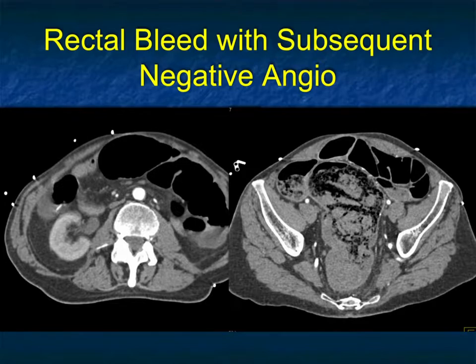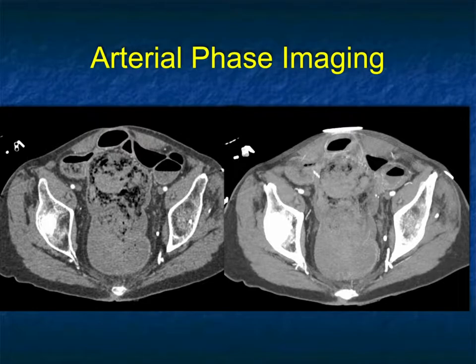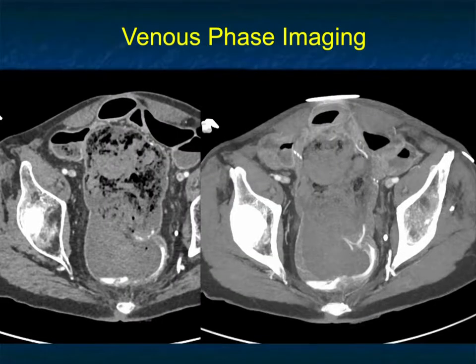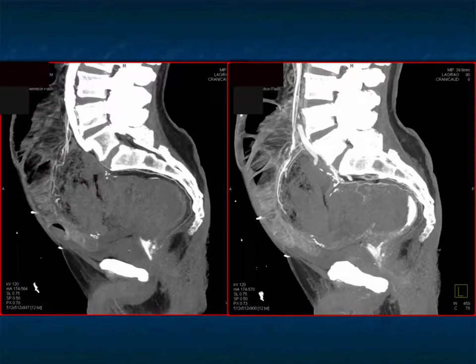Another patient with rectal bleeding. You can see some pneumatosis — something's going on in the rectum. On arterial phase you see basically nothing; maybe there's a little high-density fluid in the bowel. Sometimes you see high-density fluid in the stomach or colon but just don't see the bleeding — sometimes bleeding stops, as we know from angio and from surgery. When you see high density, you can say: I see blood, but I don't see an active site of bleeding, so that can be somewhat helpful. But here, very nicely on the venous phase, look how active the bleed is seen. We always do dual phase imaging in these cases, and for small bowel or large bowel pathology ranging from ischemia to inflammatory disease to bleeding, dual phase imaging can't be beat.